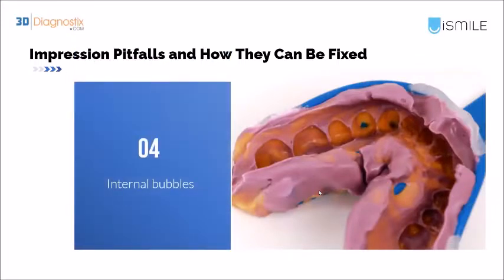And then we have internal bubbles. As you can see, we have a large bubble in the anterior segment, and we have some bubbles over there in the lingual portion of the premolar segment. And that actually leads to an incomplete impression. So we cannot move these teeth while we have this much of a bubble, because we didn't have the detail needed to move these teeth. That can be caused by either saliva contamination or trapping of air while taking the impression.